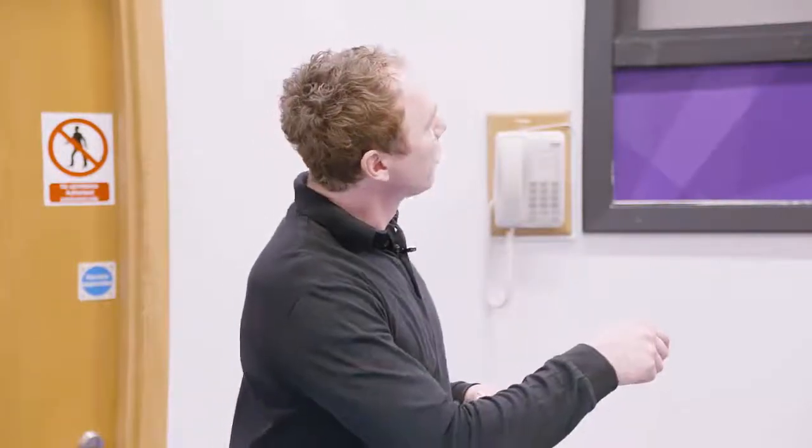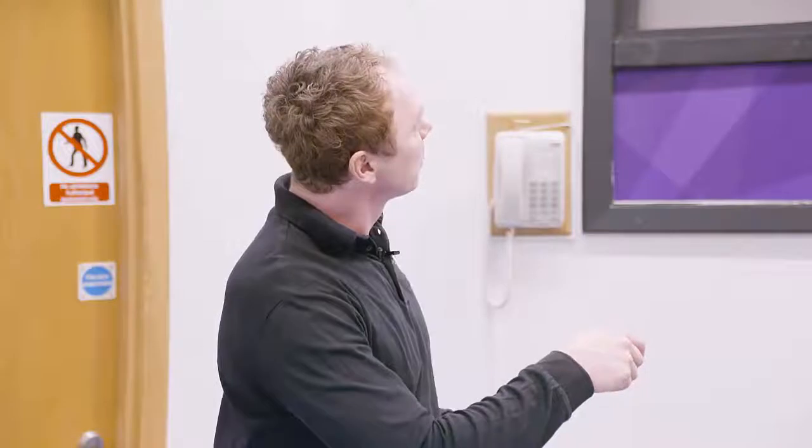In most cases, especially when you're measuring small, thin muscles, you will also stimulate deeper, neighboring muscles that will also contract, and this movement will sometimes generate a second peak, and this second peak will affect these two parameters.